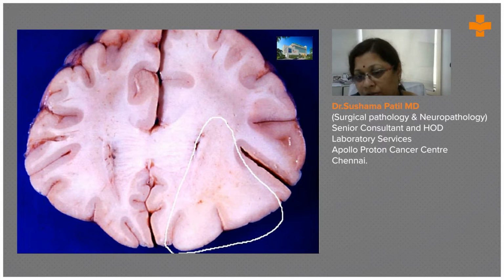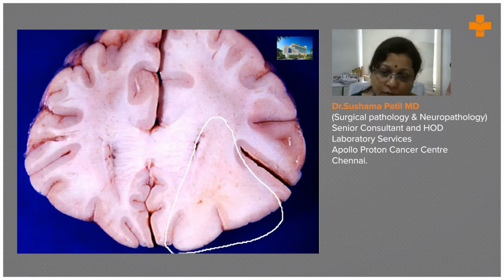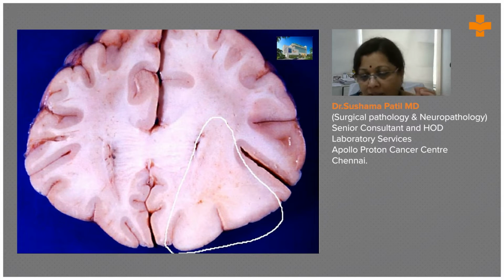So grade 2 astrocytomas, if you have a brain with you, you feel the tumor, you don't see the tumor. Okay, but if it is grade 3, they become mushy, soft, mucoid. You can see it and feel it. So when they're grade 2, they're firm compared to the normal brain tissue, and they blur the gray-white junction. This is a low-grade glioma, astrocytoma.